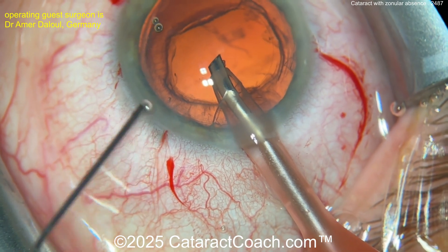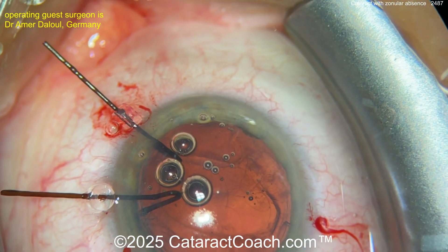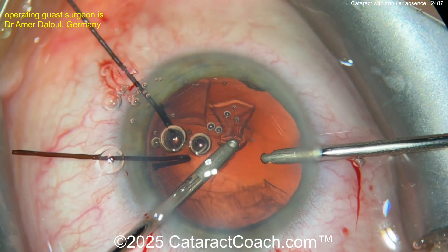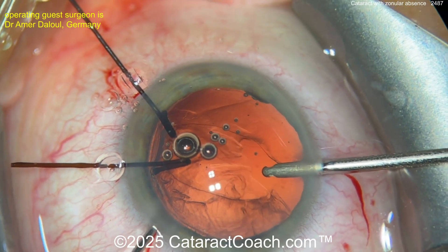You can use the chopper to hold the bag back because there are no lens capsule retractors in just yet. Put in viscoelastic — don't let the AC collapse. Great idea. There you go — those are the lens retractors, capsule hooks. They're not iris hooks; look at the shape of them, a little different, a little longer. And now bimanual IA to remove cortex — smart.